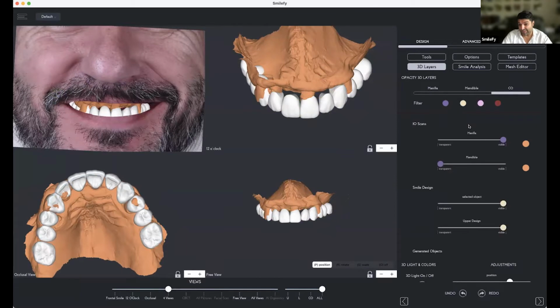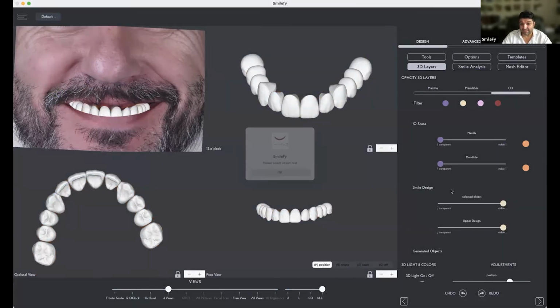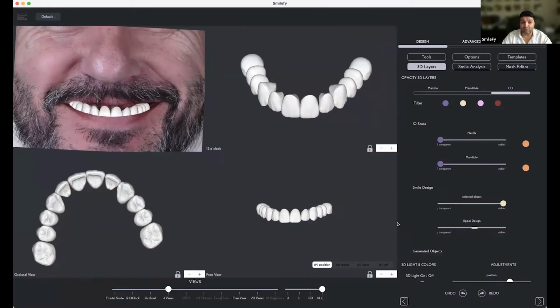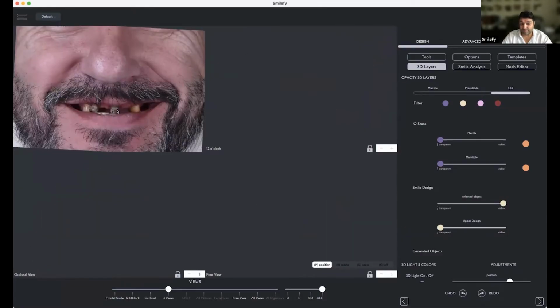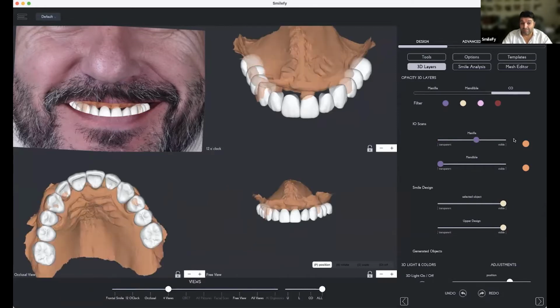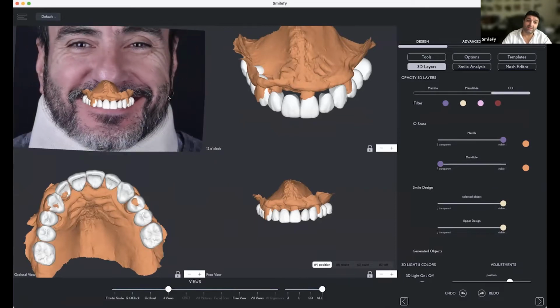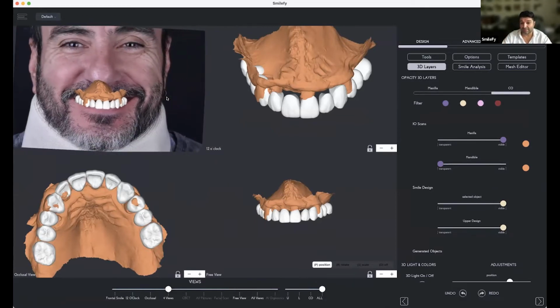Unfortunately, because the smile is not big enough, right? The mouth is not wide open. We do have, you see, now less visual reference on the face. And we cannot now really decide if the position is good or not.